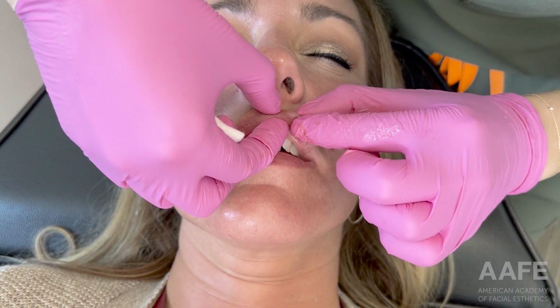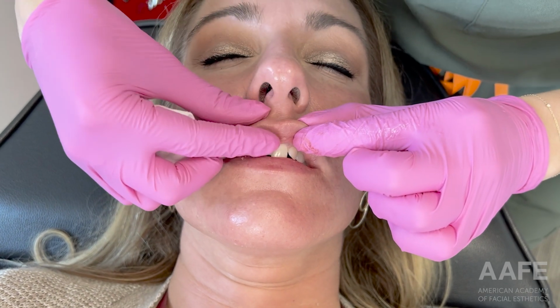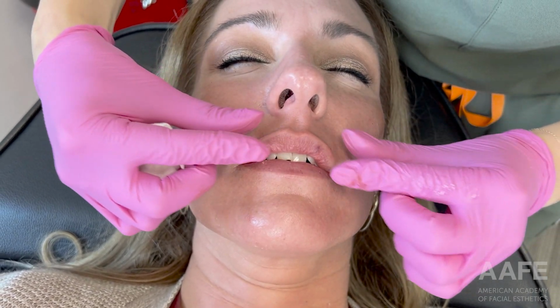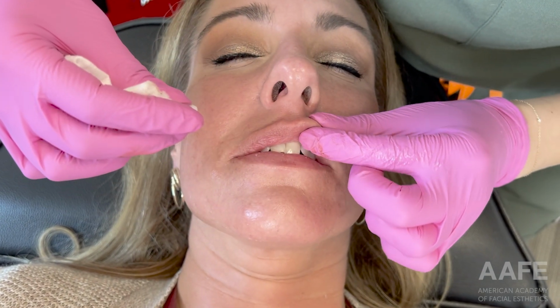I'm just trying to kind of clot off that little bruise, that little hematoma that's there, putting some pressure on it, making sure that I have even spread. And now is when I go in and kind of be OCD about everything. So yeah, just kind of working my way around.